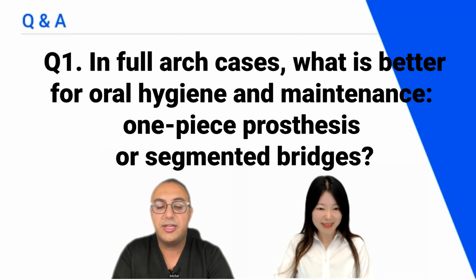Yes, it depends on the immediate loading, yes or no, and the restoration type, is it an FP1 or an FP3? Do you sometimes do immediate loading? In immediate loading, your patient cannot wait without teeth, so you have to put him immediate teeth after putting your implants. And by doing the one arch prosthesis, the connected one, you get a benefit of splinting implants together, so you decrease the micro movements, which will give you better osseointegration.